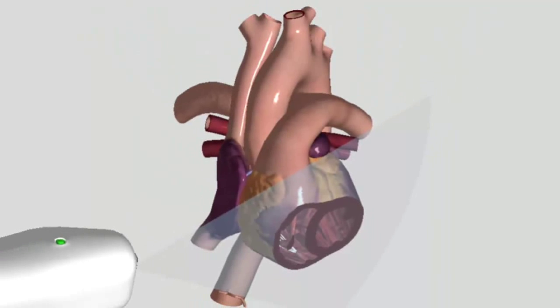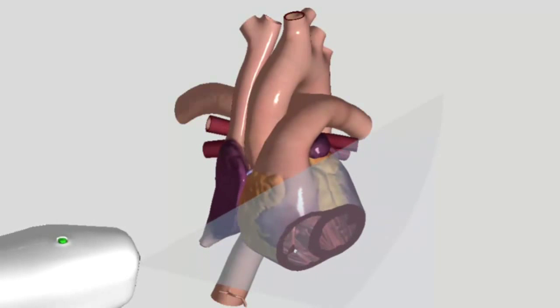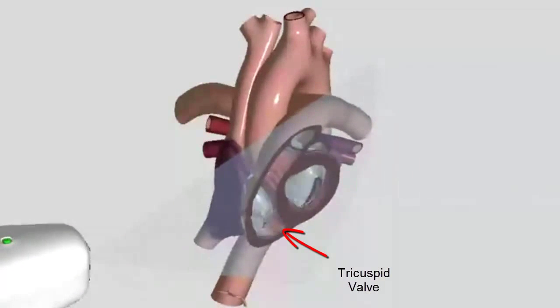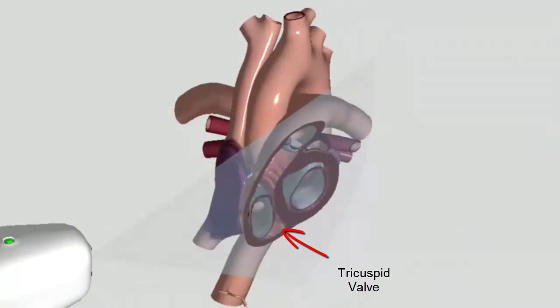So we're going to advance the video a little bit here. And so we can take a look at the tricuspid valve and see it open and close for a few beats. Just a couple more here. I'm going to stop it.